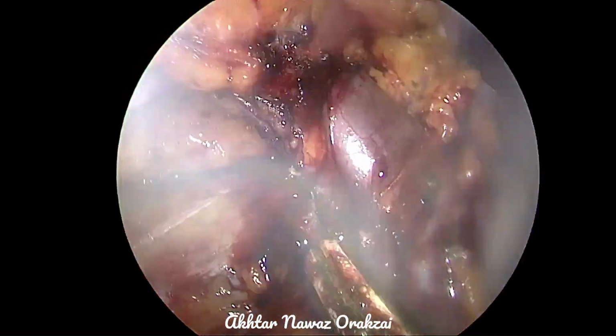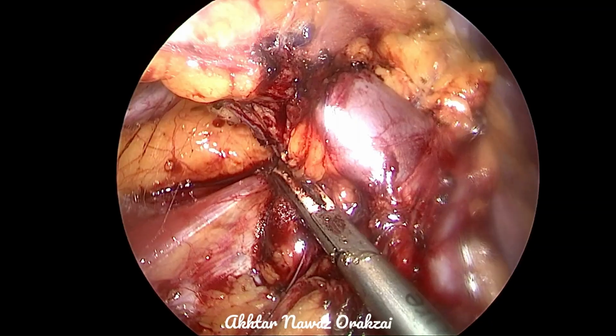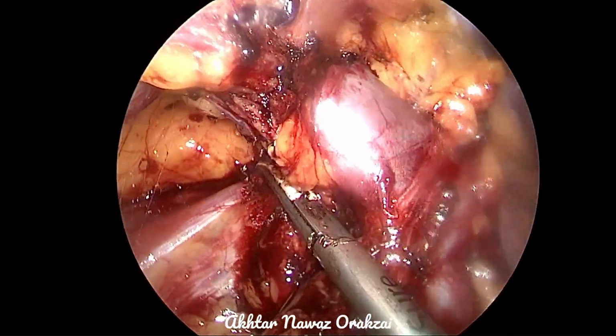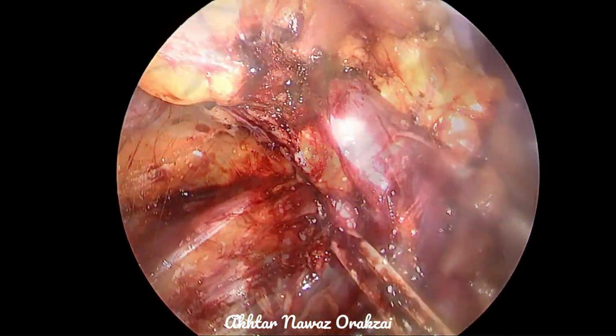So we are dissecting the artery now, but this small vein, which is draining into the renal vein, a very small one, is very worrisome, because if it gets injured, there will be a lot of bleeding and the procedure will be compromised. Here you can very nicely see the artery.